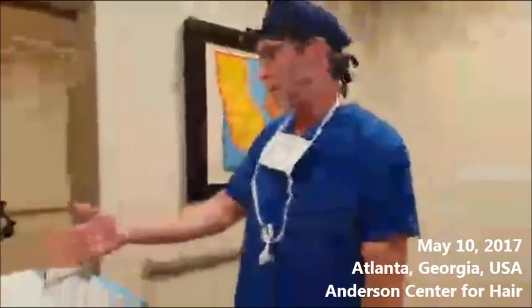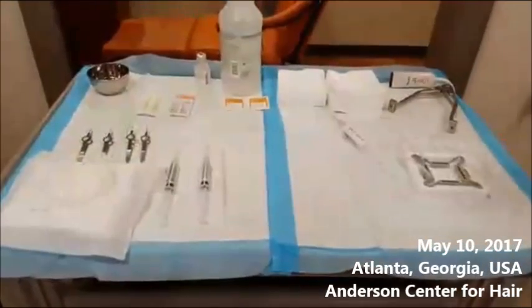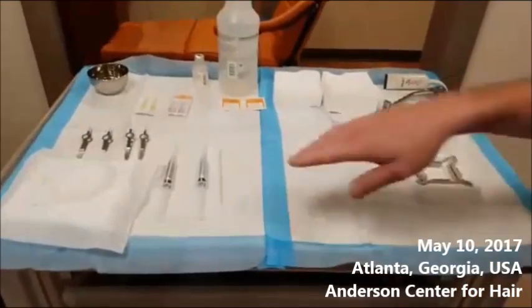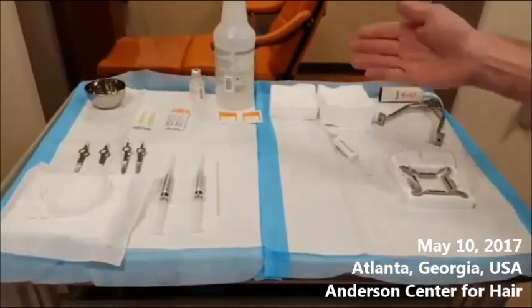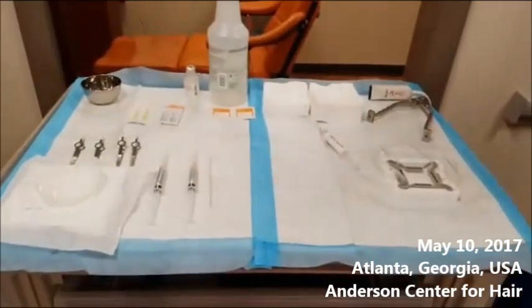Come on over here. We're going to have a look at our instrument tray. We've got the tensioner, the tool, the peanut. We've got the Marcaine, some syringes, some forceps, some gauze, saline, chilled pads, and a beautiful card.